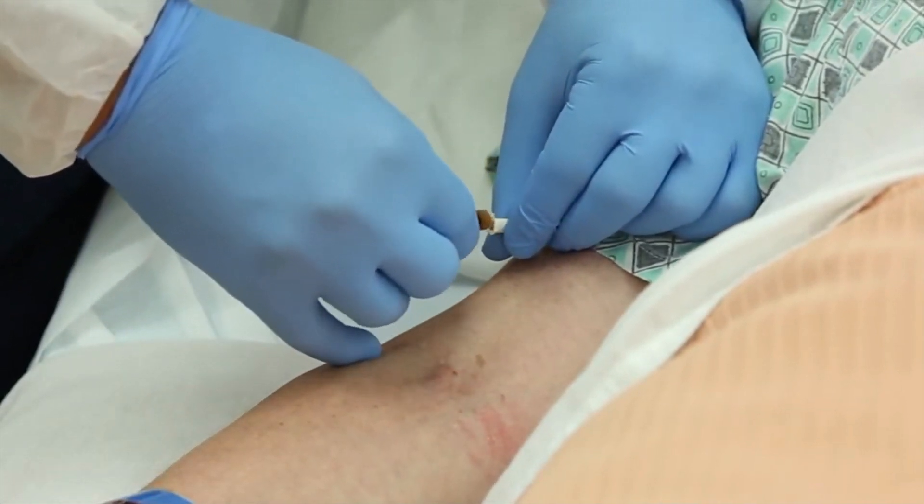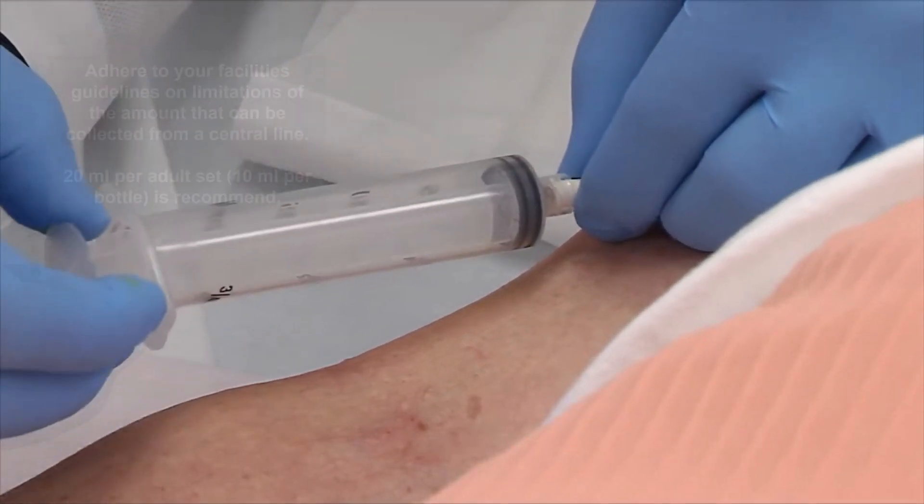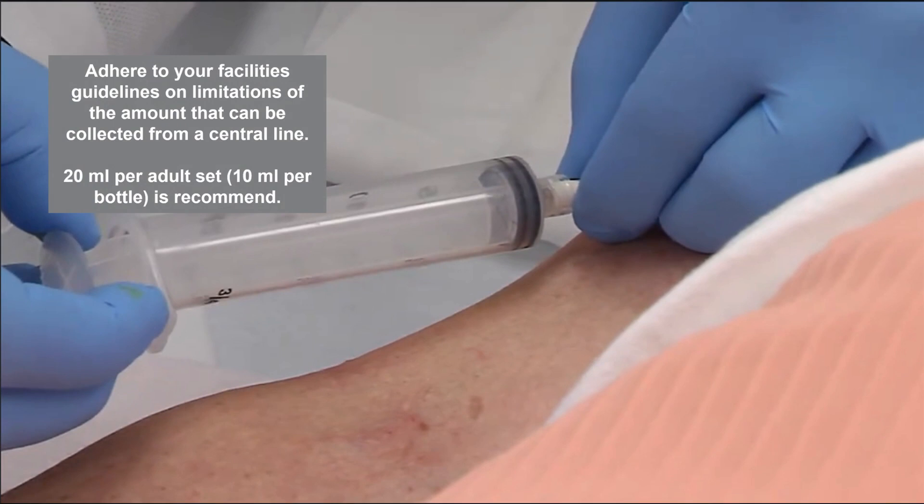Disinfect the central line port as recommended by your facility's approved procedure. Using a syringe, aspirate the appropriate amount of blood, adhering to your facility's guidelines on limitations of the amount that can be collected from a central line.